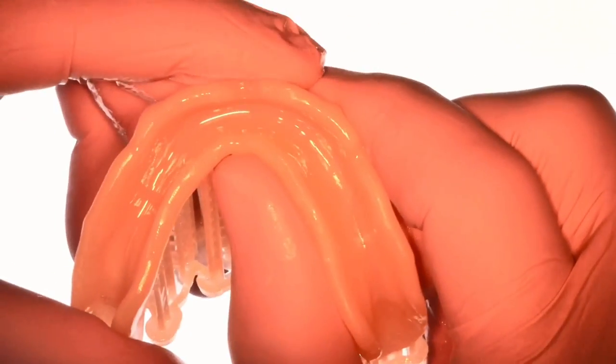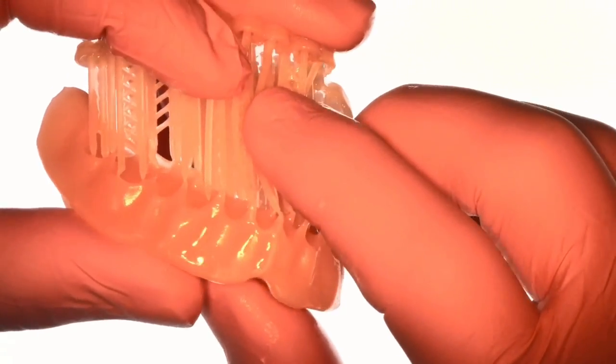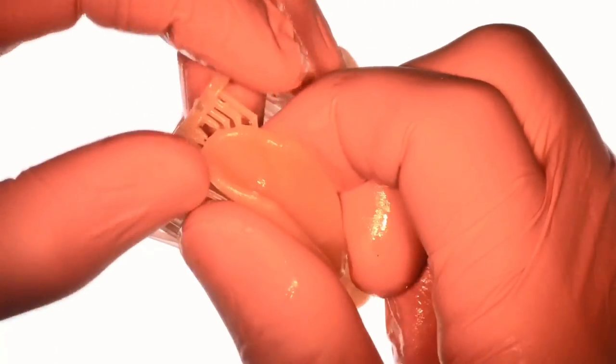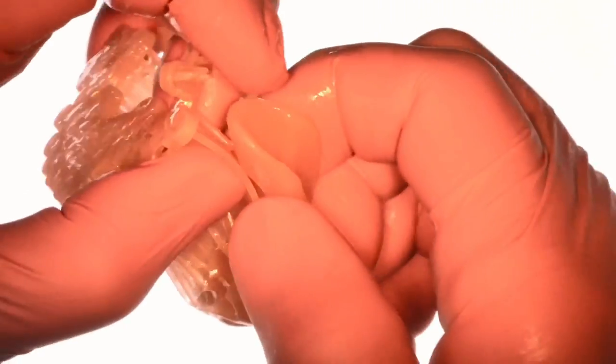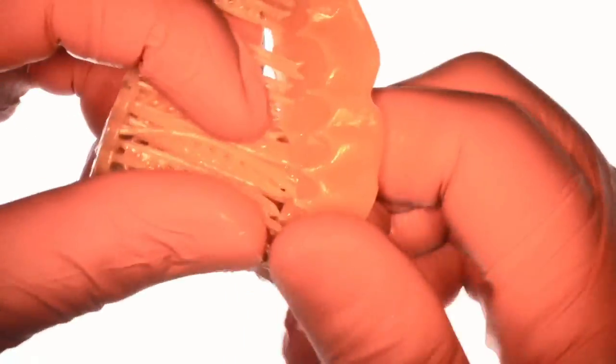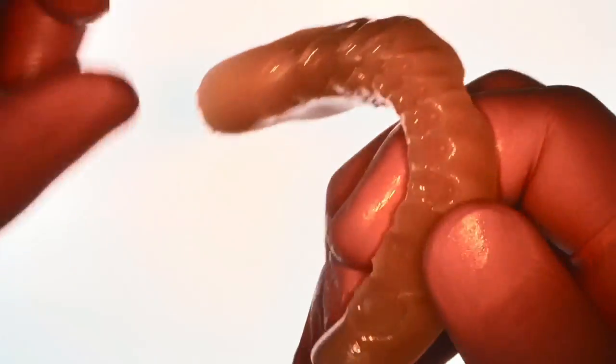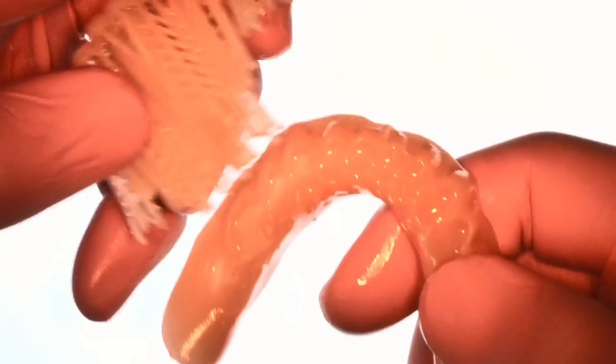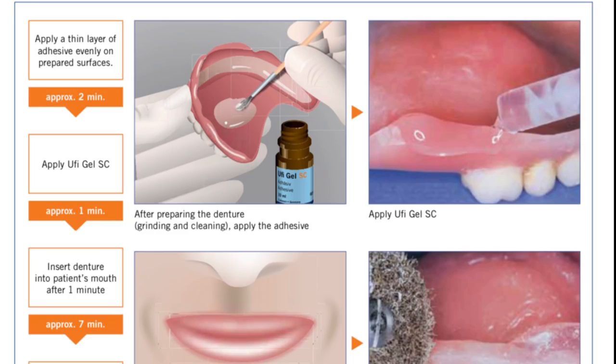But again if you're printing a permanent denture you do not want those support tips on the intaglio surface. And what you're trying to achieve with these is easy peel supports avoiding the tooth sockets as much as possible so that you don't have to adjust fitting of the teeth into the sockets.